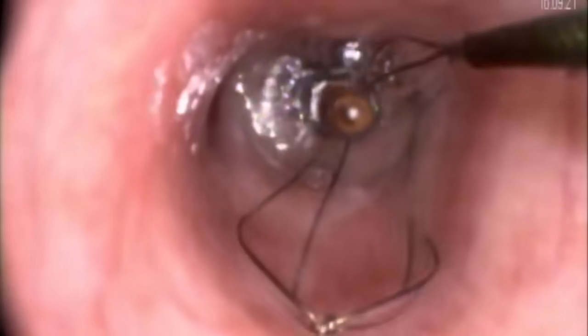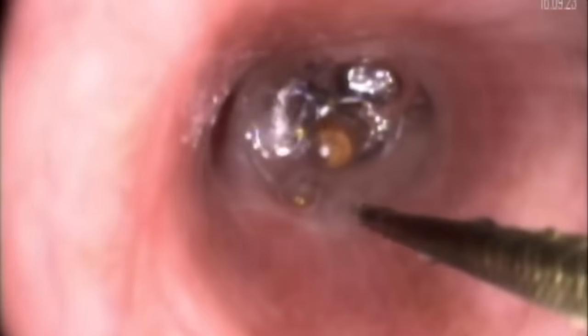For our first attempt to remove the pin, we use the 12mm airway retrieval basket. When the basket is deployed, a meshwork of flexible wire with a circumferential shape comes into view. The purpose of the basket is to loop the flexible wire around the foreign body and then tighten the loop around the foreign object, allowing it to be removed.